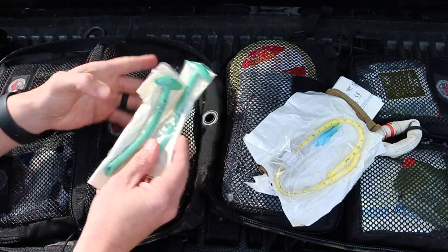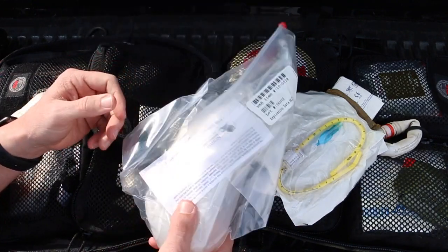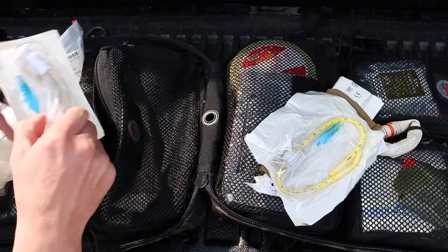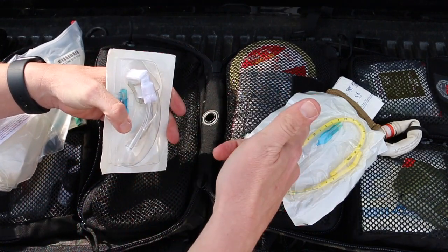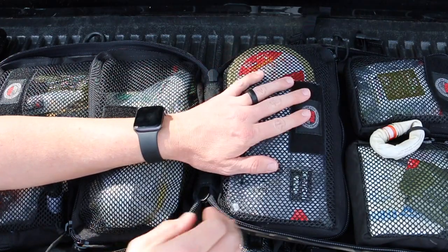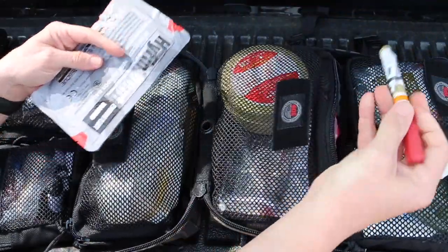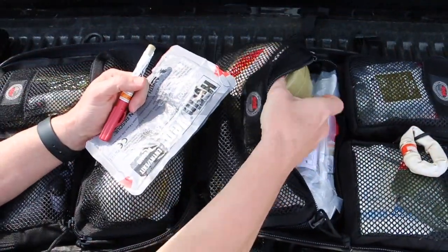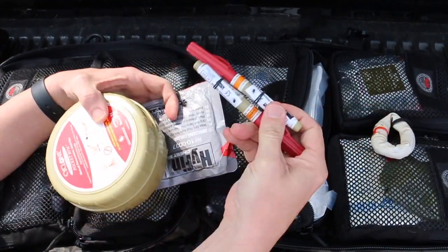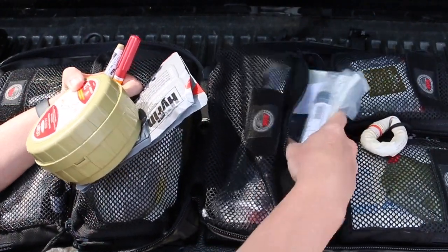A couple of NPA airways. Then we have a tactical suction device — basically a turkey baster — I can use it to clear someone's airway. And then the tube for the Cric: cut, use a Bougie, insert the breathing tube. In the next bag for airway and breathing, I have chest seals, a ported decompression needle — actually two needles — and a King airway that I can insert if needed.